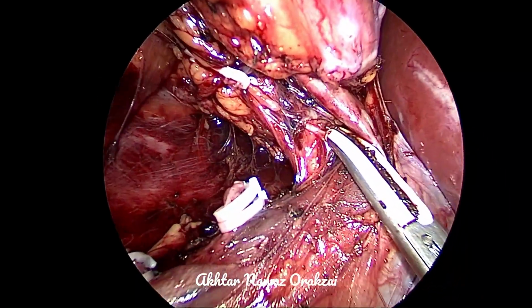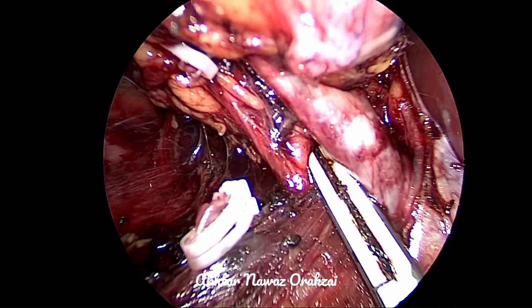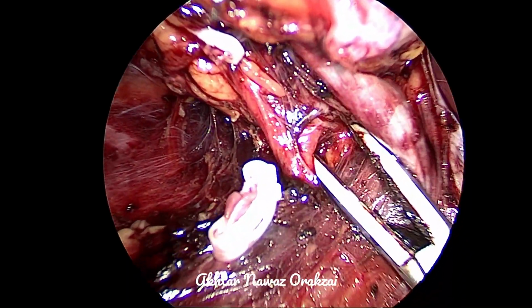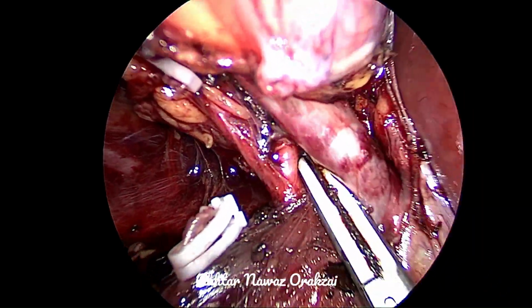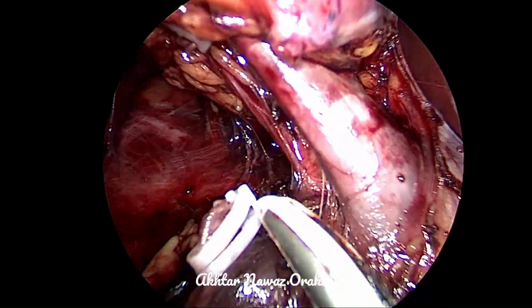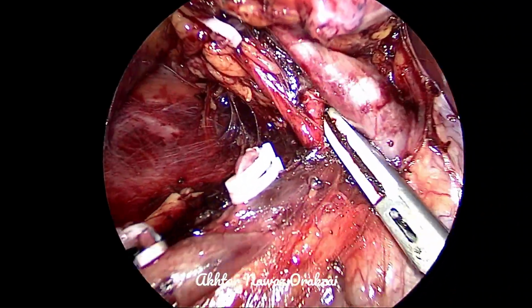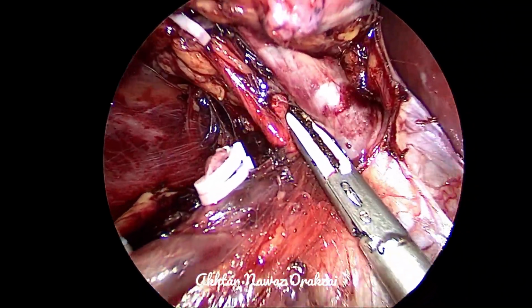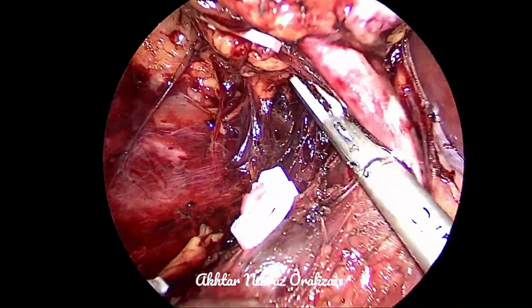We have already clipped one artery, which has already reduced the blood in the kidney, and the second thing is that we have found the artery, and we have also found that it's not possible to dissect this artery before clipping this vein. So we clipped it and then divided it, and now we are doing the artery. You can see there's a main trunk which is coming behind the inferior vena cava, and then it is dividing into two branches in the shape of a Y.